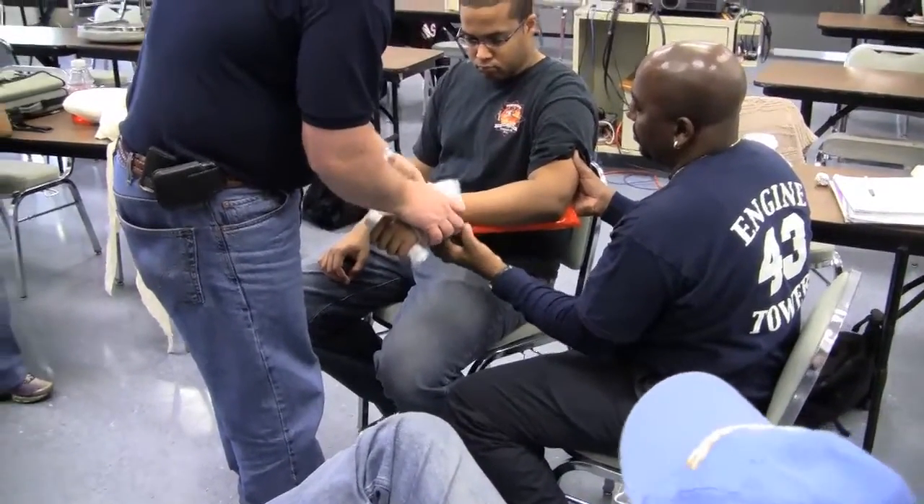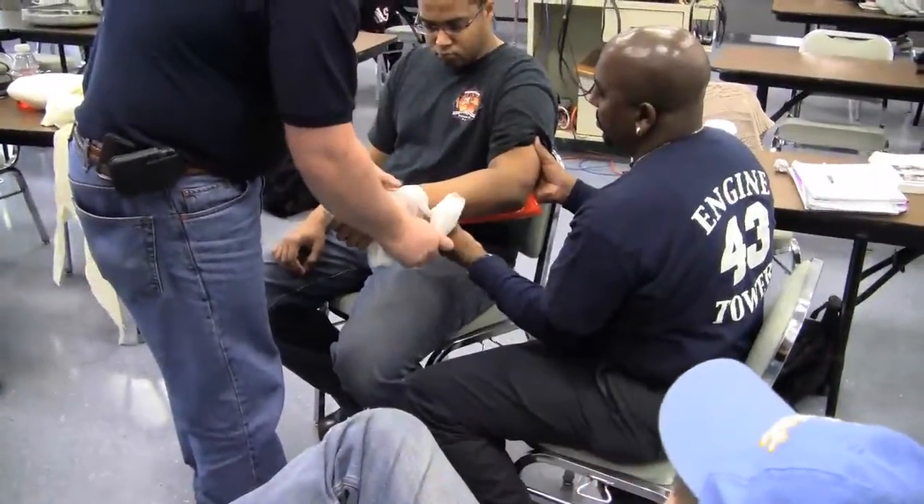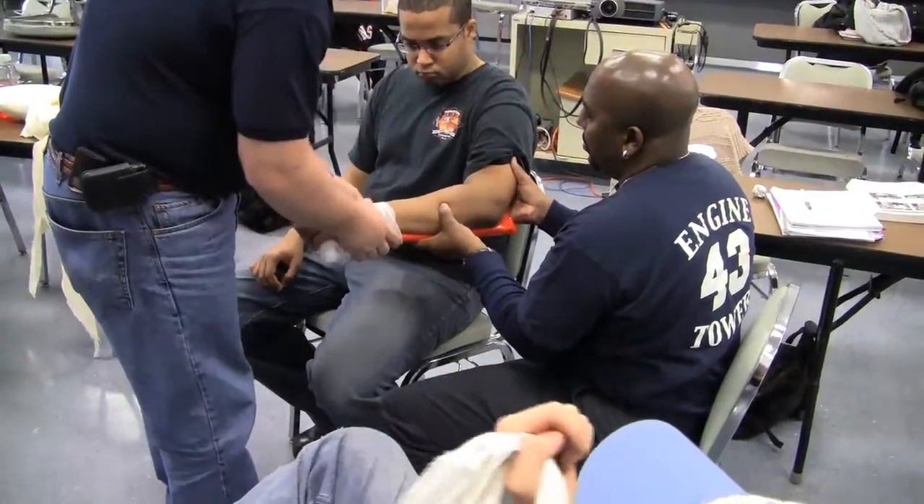Distal to proximal. We're going to wrap his arm up. Not covering the fingers.